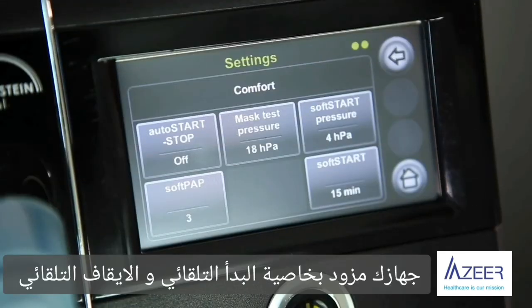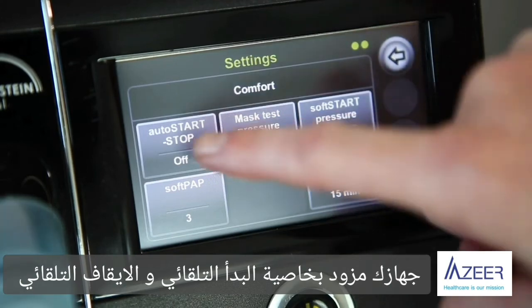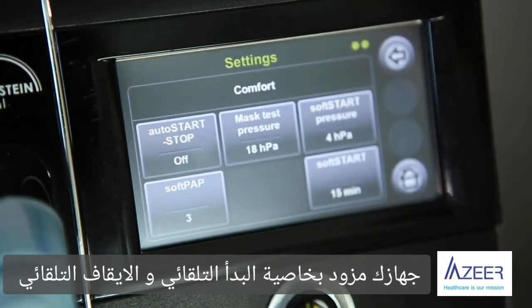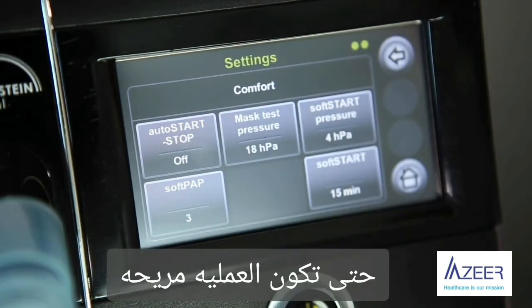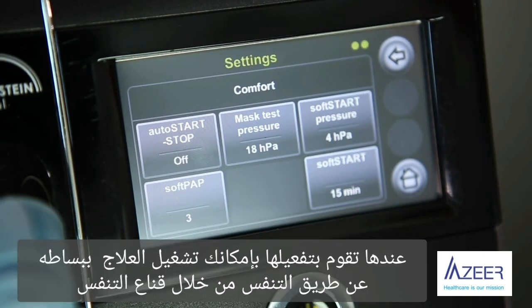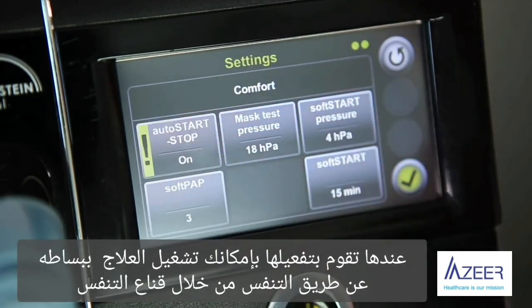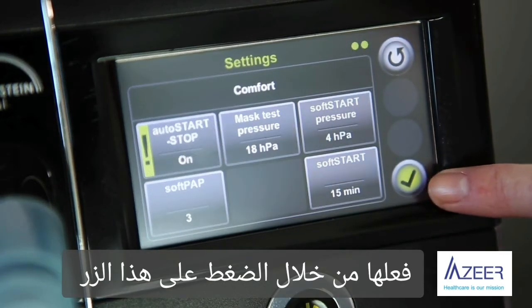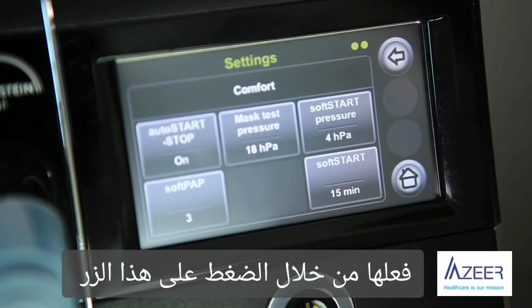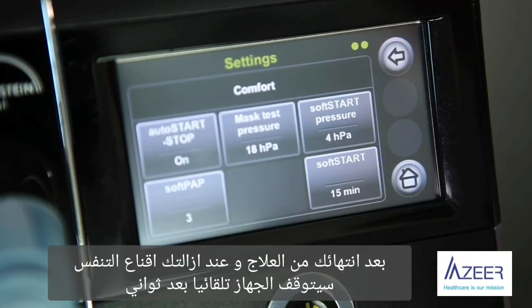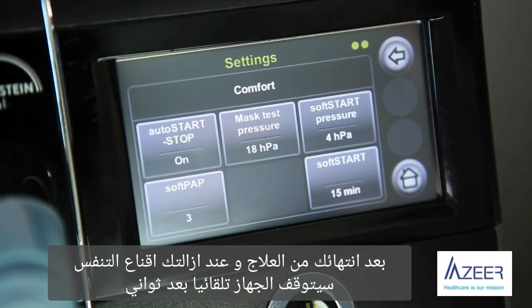Your therapy device is equipped with the auto start and auto stop function to make its operation even more convenient. When it is activated, you can switch on the device simply by breathing into the mask. Activate it by pressing the button here. After your therapy, when you remove the mask from your face, the device switches off automatically after a few seconds.